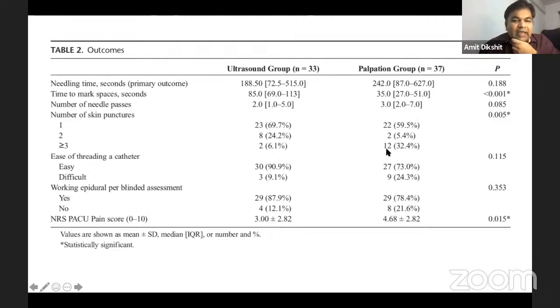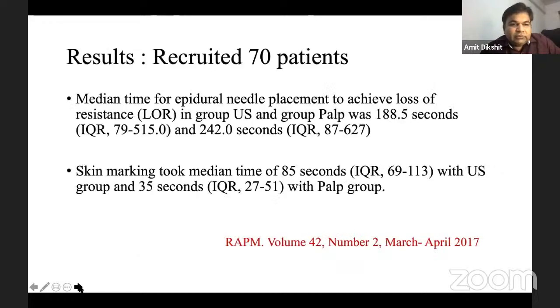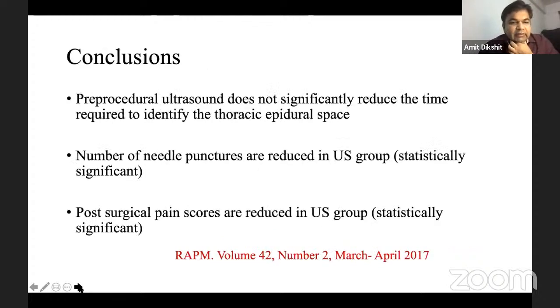So everyone will agree that in some patients it is difficult, it continues to be difficult, and we don't know how much time we have spent. That sort of embarrassing situation can be very well avoided with the use of a pre-procedural scan. So they have compared the data, and they found that the ultrasound technique is better, and it was statistically good. Even the post-surgical pain, because we could exactly note where the epidural has been placed.